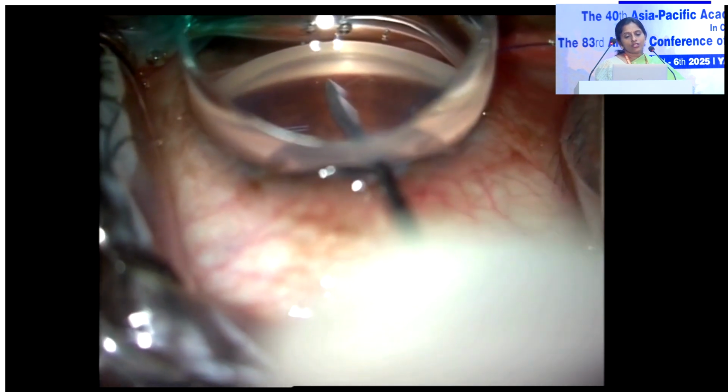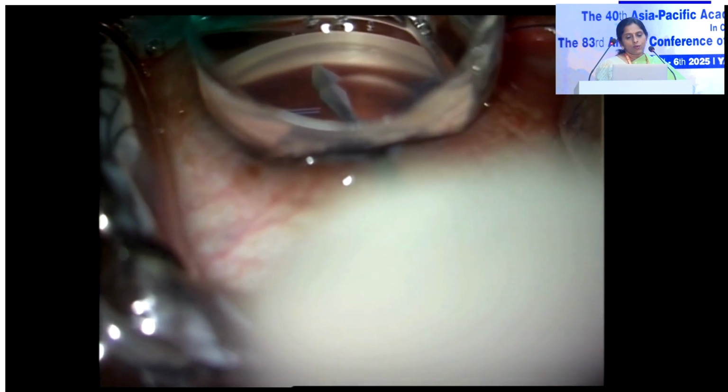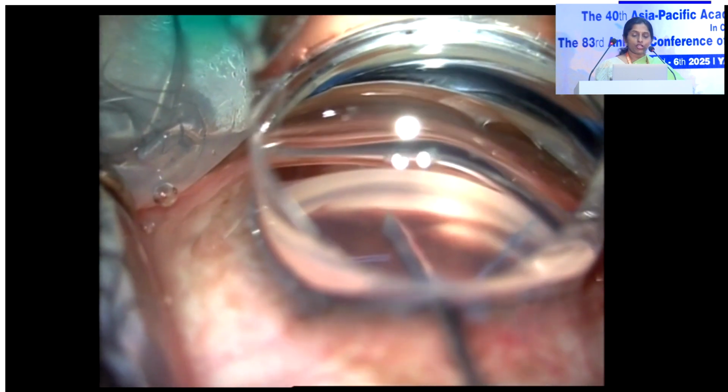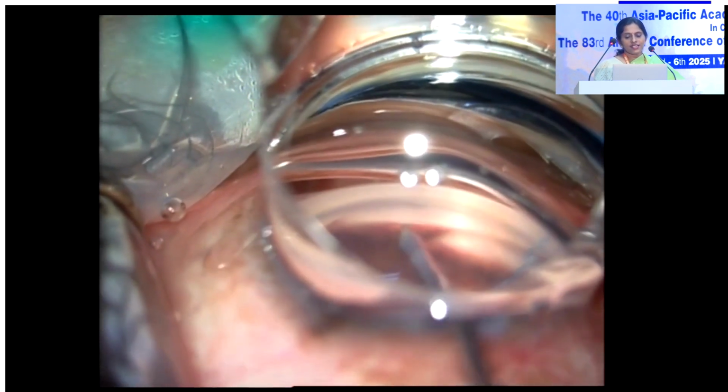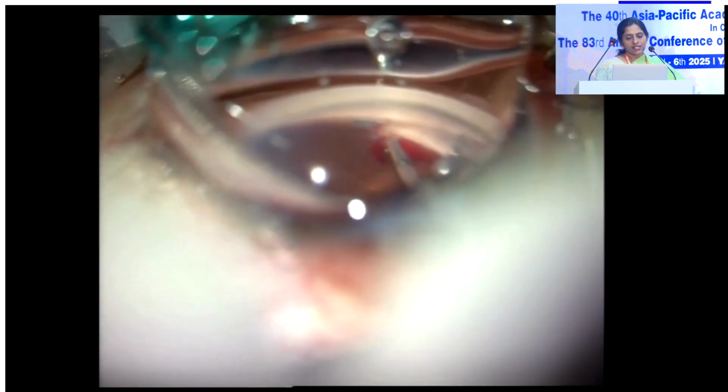And this is another surgery, a GATT surgery, being performed here. So the initial incision you make on the TM is done with an MVR blade. Once we do this, again there may be some bleeding points that you see. It is important to visualize what you're seeing. Without visualization, you may not be able to proceed with the surgical steps, number one.